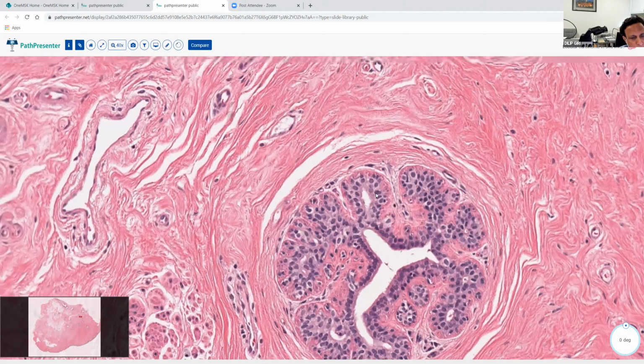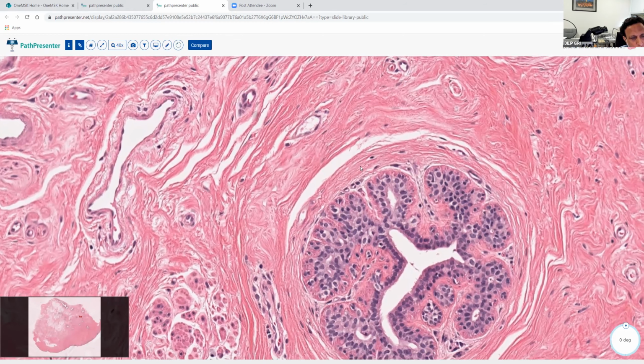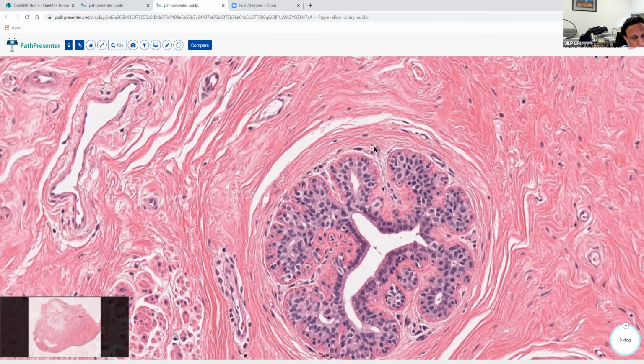So in the interpretation of E-cadherin stain, there are a few things to remember. One is you should be aware that even in pretty straightforward LCIS, the lobular carcinoma in situ cells, the cells that form LCIS, they can kind of squish the native ductal epithelial cells.